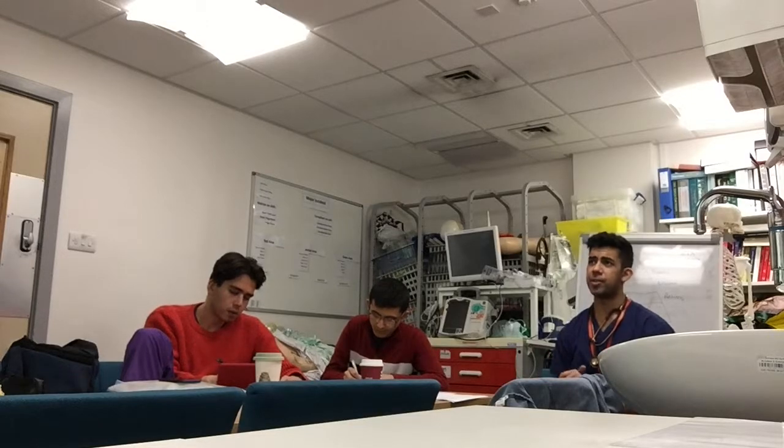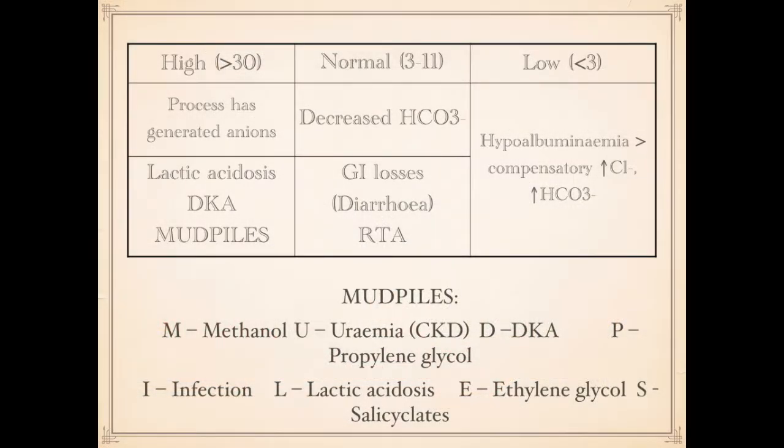Okay, so this is really to help you extrapolate causes of a metabolic acidosis to a certain extent. If we calculate the anion gap with the sodium, bicarb, and the chloride based on what you've got on the blood gas, and it's elevated, then that's telling you a process which is producing these anions essentially. Anion, is that positive or negative? Negative. It's negative, yeah. So there we go.